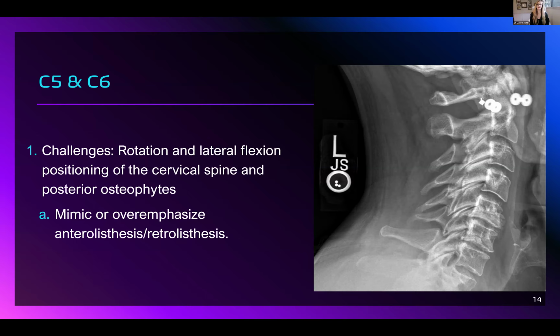Right. Would you say that initial x-rays are to rule out fractures and things like that, and whether they need an MRI, whereas you're really going to get this ligament diagnosis later? How long after the acute phase would you say is the earliest stage that they should do that repeat x-ray to really see that motion?